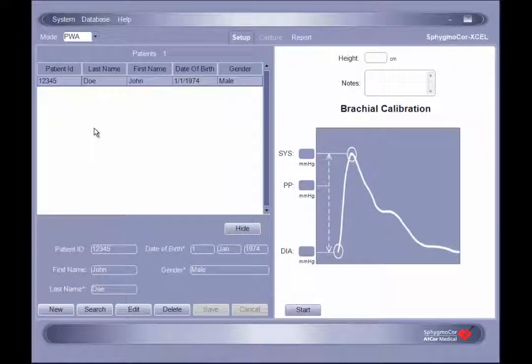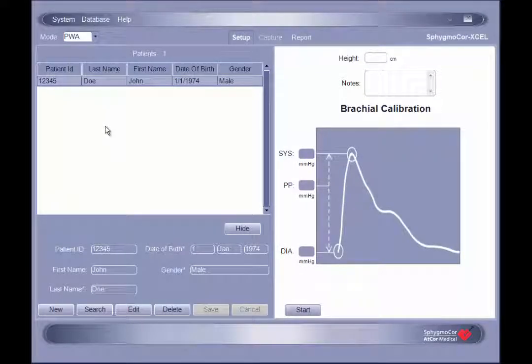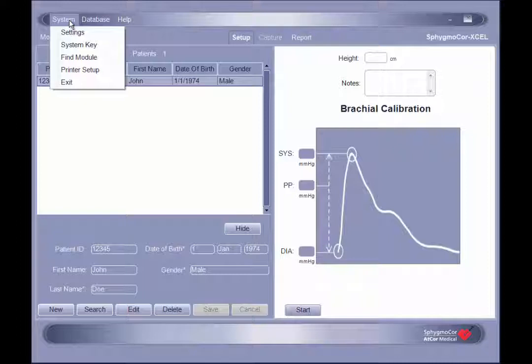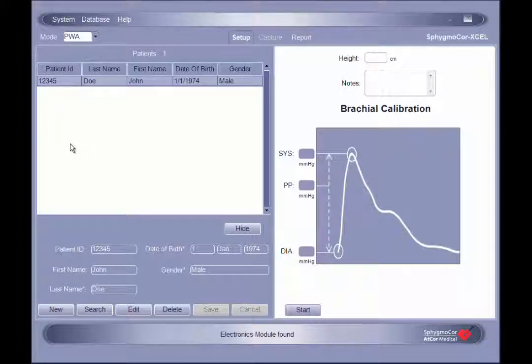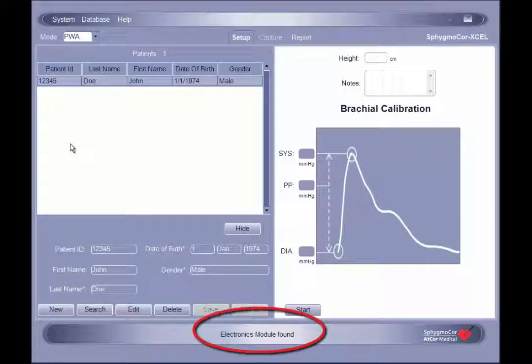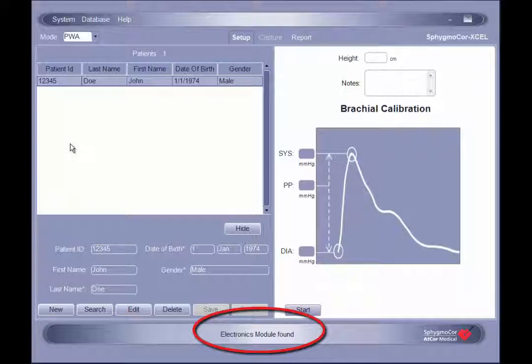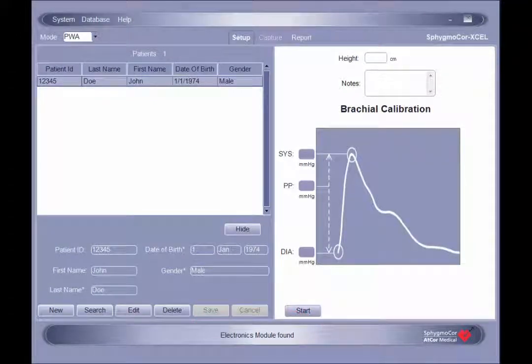To establish communication between the software and the SphigmaCore XL module, click on System in the upper left corner of the toolbar and select Find Module from the drop-down menu. If communication has been successfully established, a message stating Electronics module found will be displayed in the notification area at the bottom of the screen.